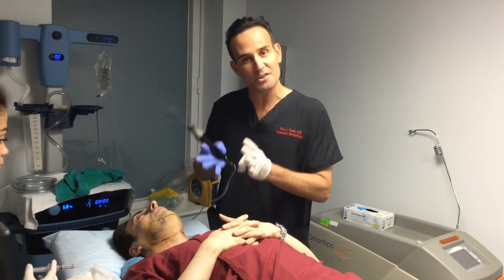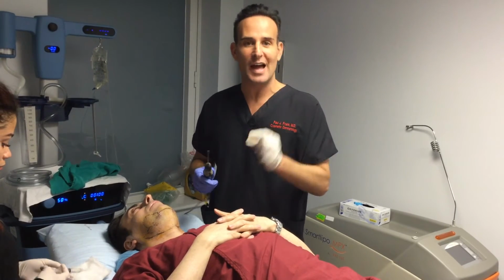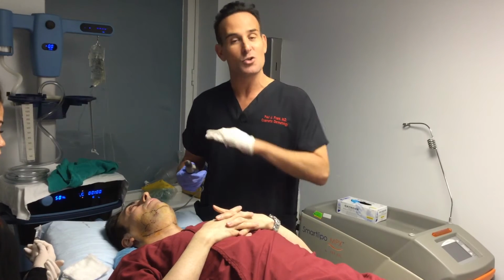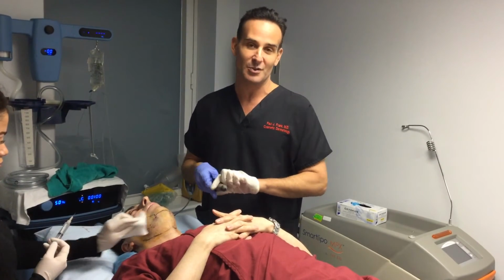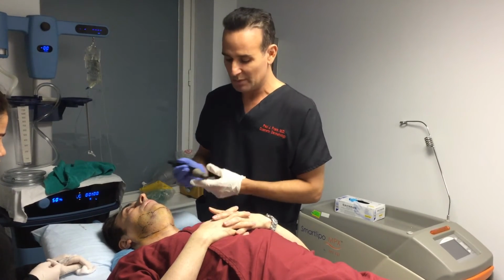What I've done is I created a space in between the skin and the muscle where I could access the fat and get underneath the skin and kind of use heat of this ultrasonic wand to iron out the skin and tighten it from underneath. So again, whereas the non-invasive technologies work from outside, we're working from the inside.